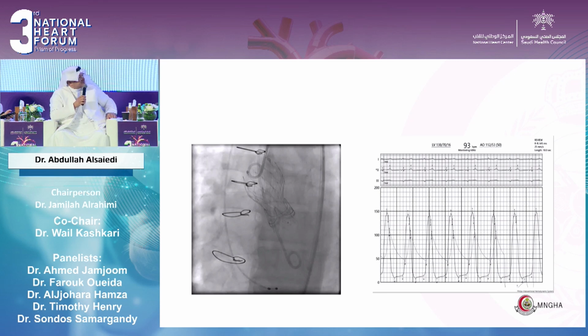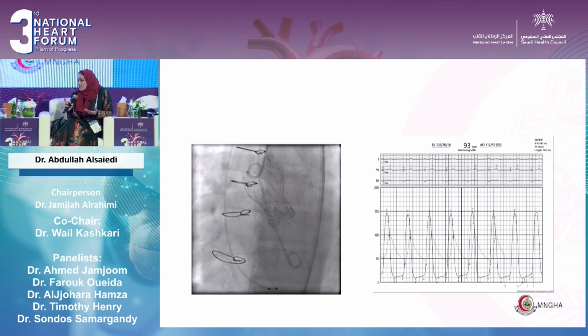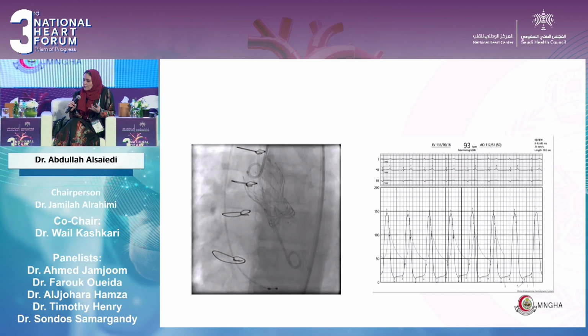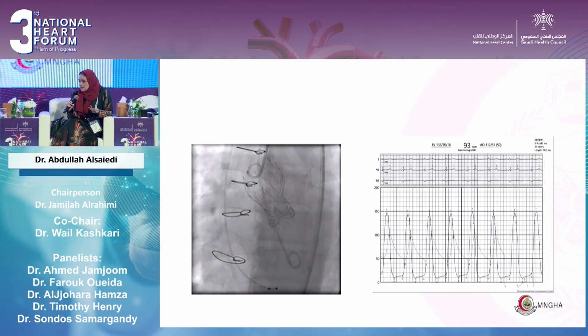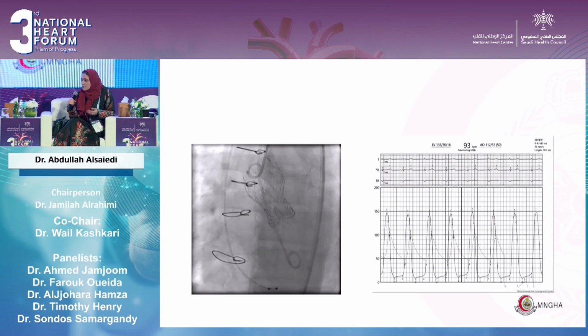For me, I don't like to fracture before. I would like after. And again, this is a self-expandable valve. It's going to keep expanding, to some limit, of course. So that's why first of all, I would go for a self-expandable valve. Second of all, I will feel more comfortable considering that the coronary sinuses are good. And then I will not put in a bigger valve, because we already know the inner diameter. What we're going to gain, 2 millimeters extra after the fracture, or 3, is not going to push a full size from 26 to 29 or from 29 to 34. So it's not going to be a major jump.